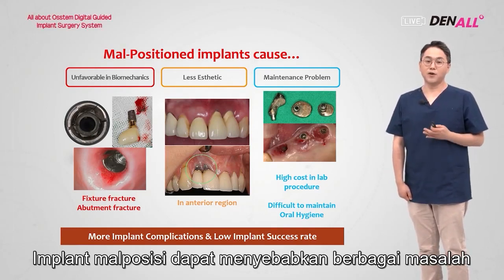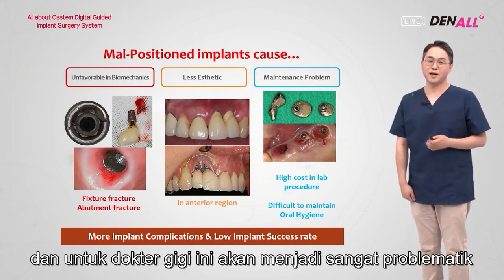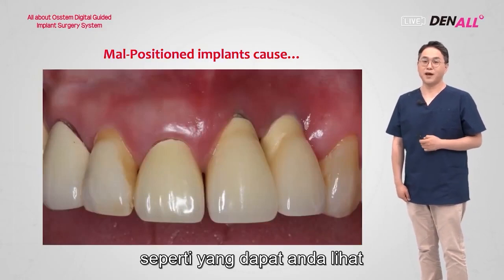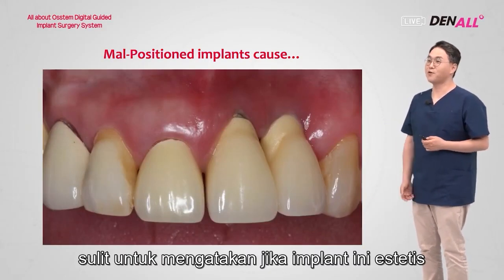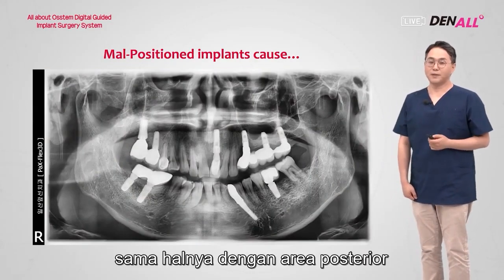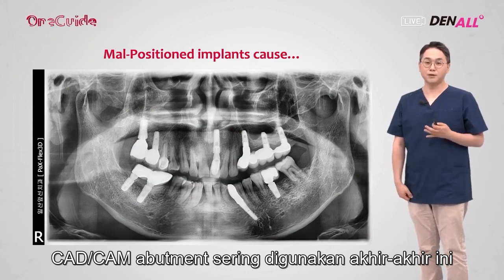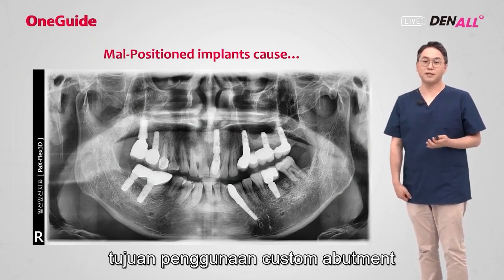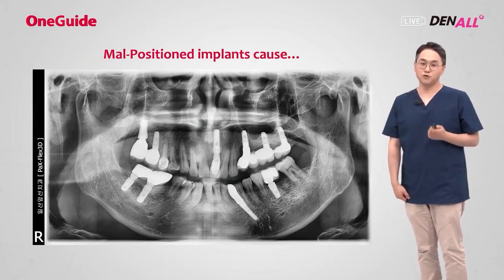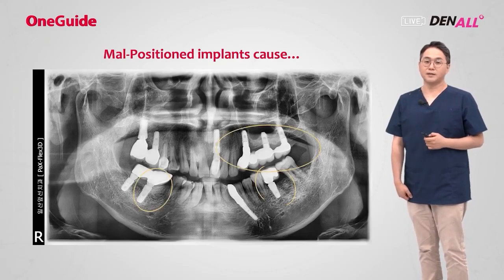Malpositioned implants can cause various issues, and for dentists, it can be very problematic. As you can see, it's difficult to say this implant is aesthetic. It's the same in the posterior area. CAD-CAM abutment is recently used a lot, and people use custom abutment for prosthesis, but in terms of maintenance, as you can see, these problems can occur.